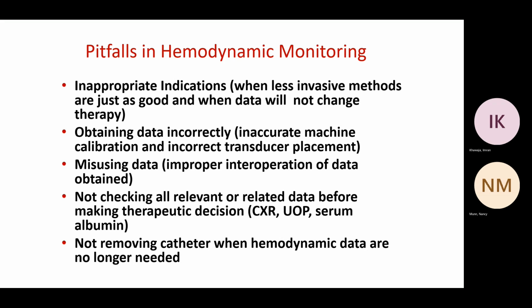We did cover the indications. There aren't universally accepted indications, but there are common ones you can use to justify putting in the catheter. You want to make sure that whatever you're trying to achieve by putting in your catheter, what you get is valid and accurate, because if not, you can apply it in a harmful way to your patient.